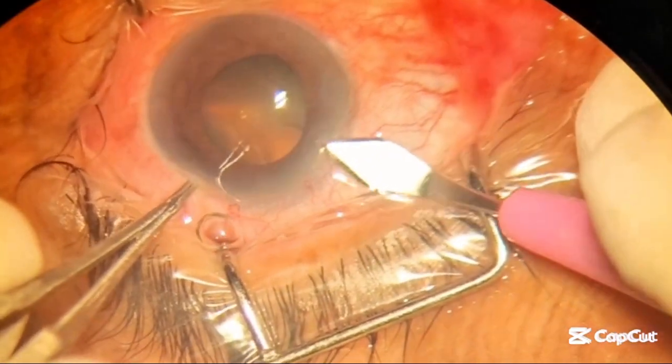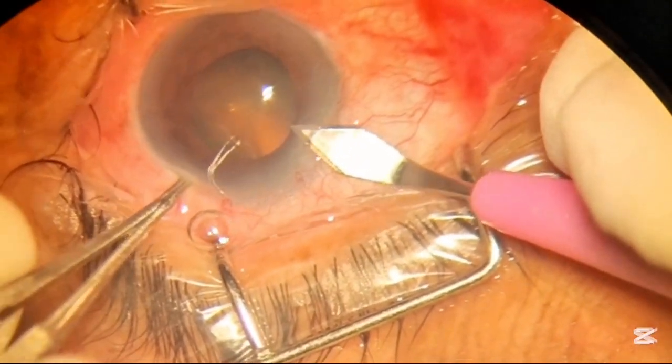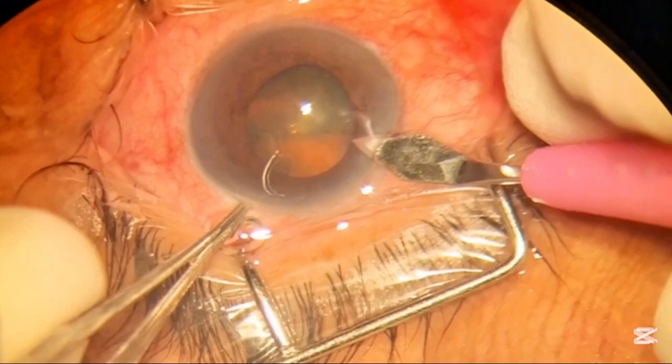Hello, my name is Dr. Faisal Anwar. Today we will see how we perform cataract surgery in routine.